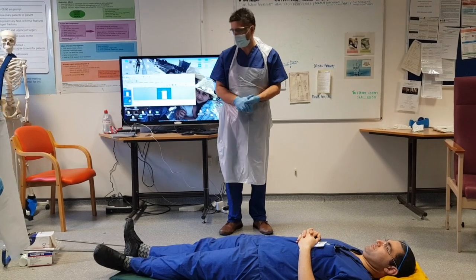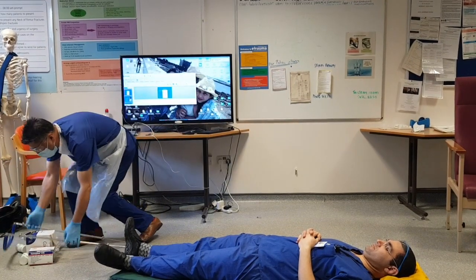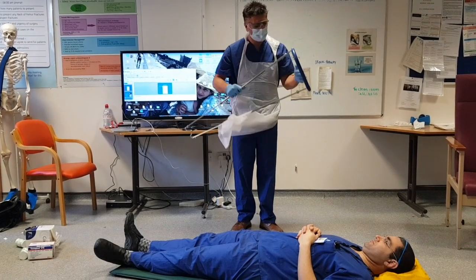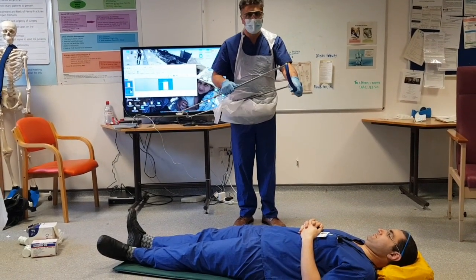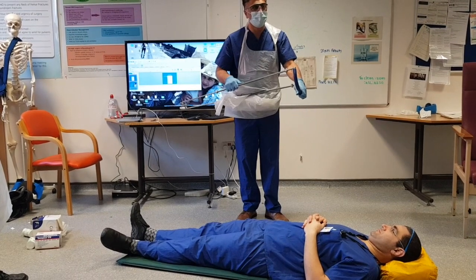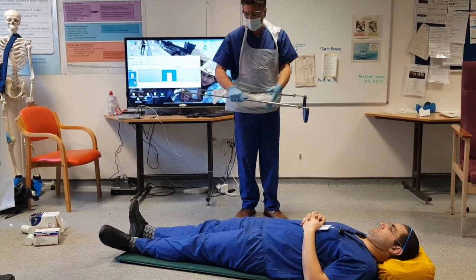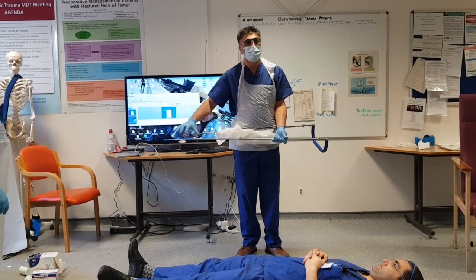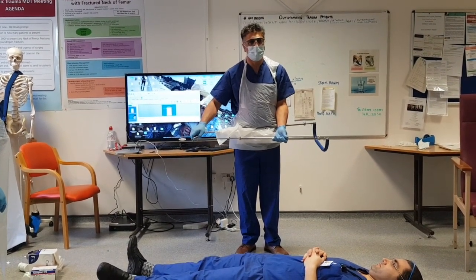We're going to make sure that we've got all the right equipment. This is a Thomas splint. The way that this works is that this part of it is going to push on the ischial tuberosity, and then the other end of it is going to be attached to his ankle and we're going to literally pull them further apart.